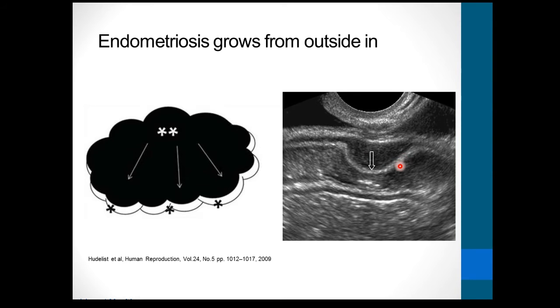And it is only at that time that the lesion can also be detected on colonoscopy, because a colonoscopy in this situation will be normal because the lesion is completely outside in the outer layers of the bowel and is not breaking through the inner layers of the bowel.